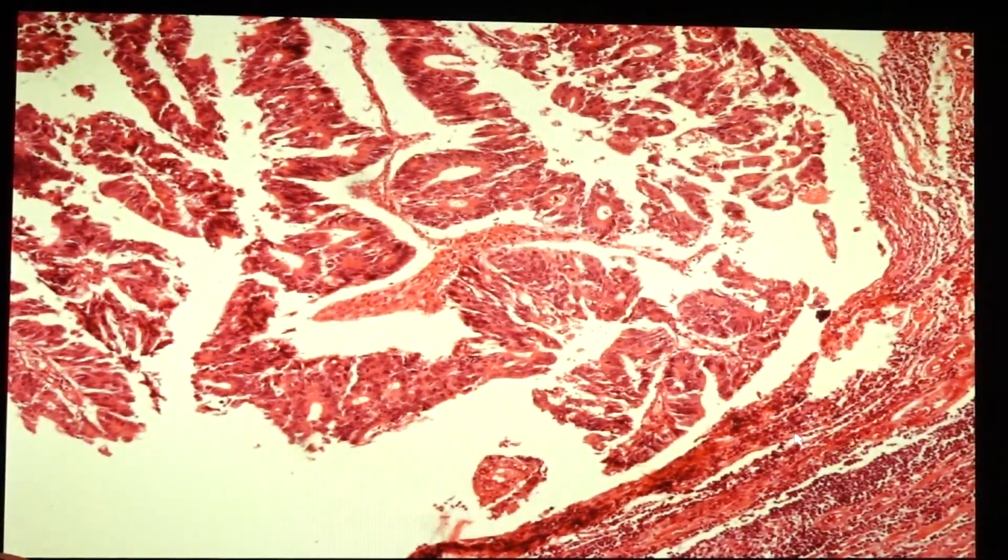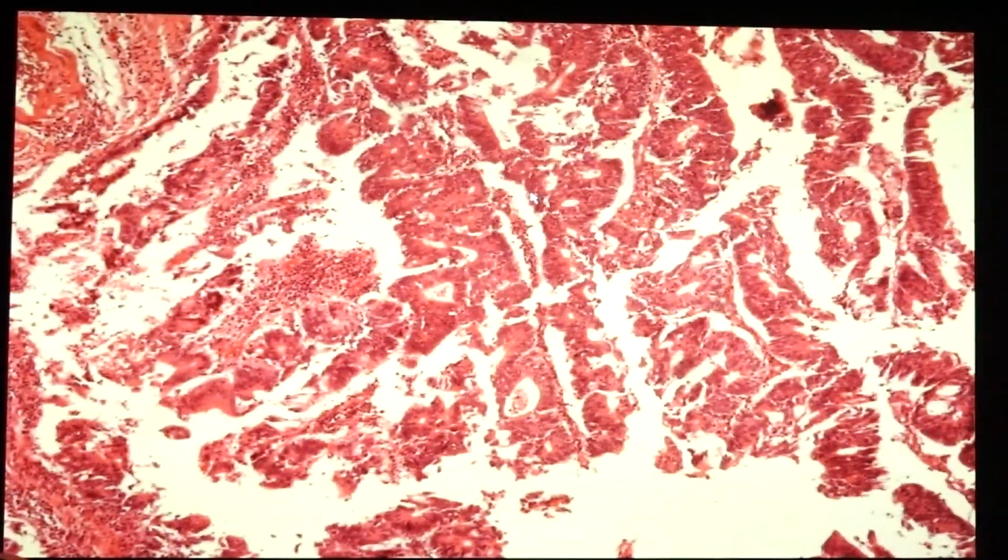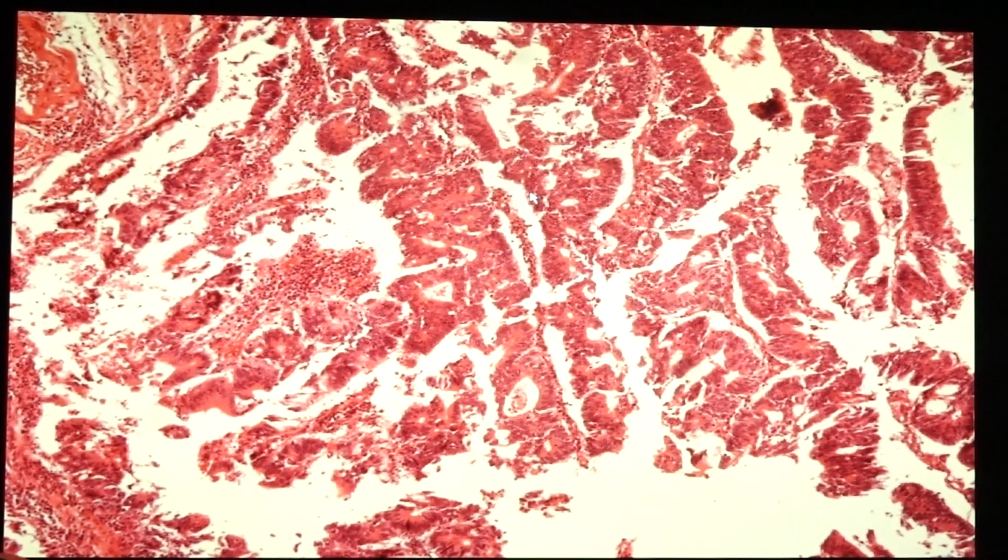Now you look for atypical glands. So this is adenocarcinoma of the colon. So you would see the presence of the atypical glands in back-to-back pattern. Okay, so no intervening stroma in between them. And with regards to genetic mutation, sporadic cases of colonic cancer would be seen with APC genetic inactivation, seen in 70 to 80% of cases.